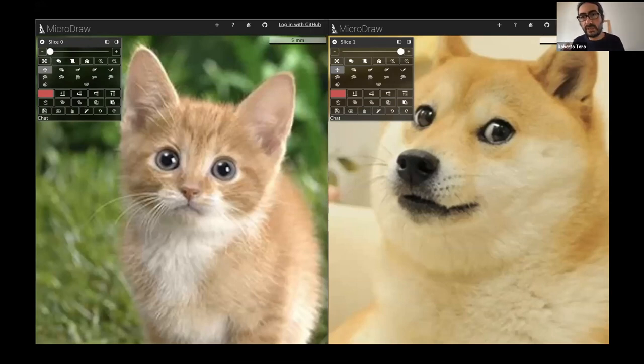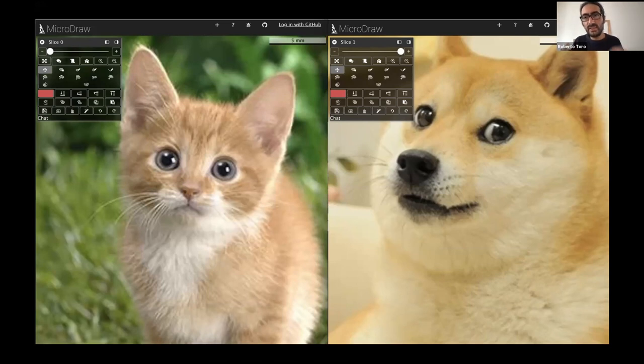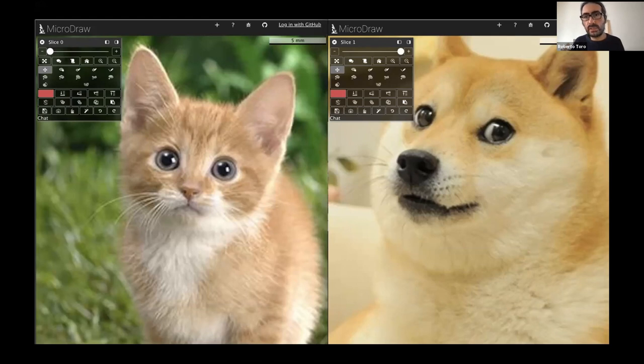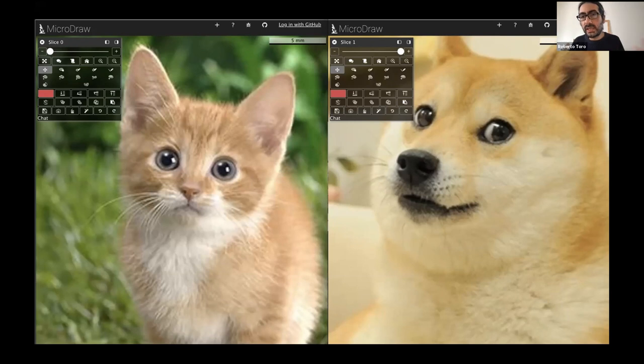Let's say that we have a data set that has these two slices, one with a kitten and the other one with a dog, and how do you get that data into MicroDraw? The data can be hosted anywhere. You can host it yourself or it can be hosted by some other service.